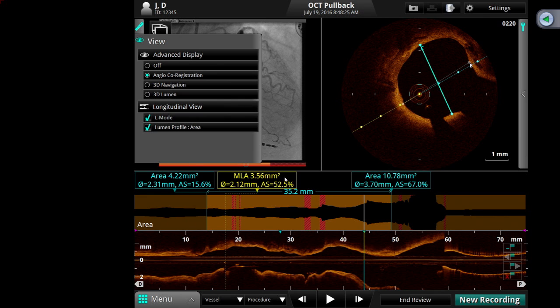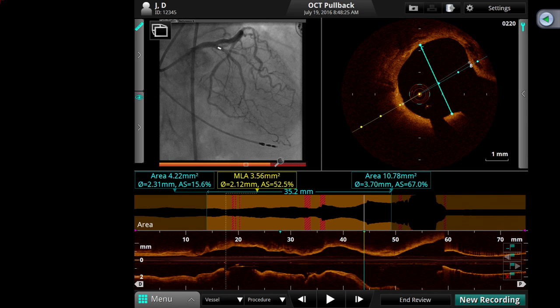The specific question for you is: even if angiographically I am convinced to put in a 3.0 for the first 10 cases, is it good practice to use OCT, or IVUS if you don't have OCT available? This question was specifically asked for OCT, I believe they have OCT. Okay. Chuck, what would be your answer? Angiographically they feel comfortable, but for the first 10 cases, if OCT is available, should they use it?